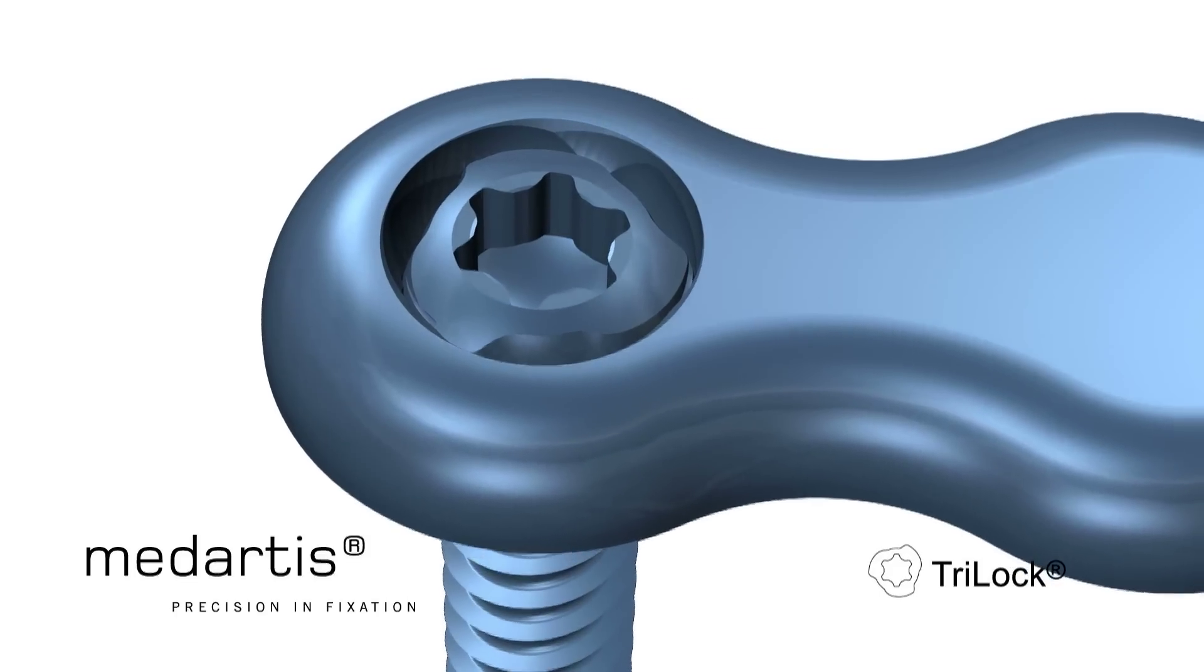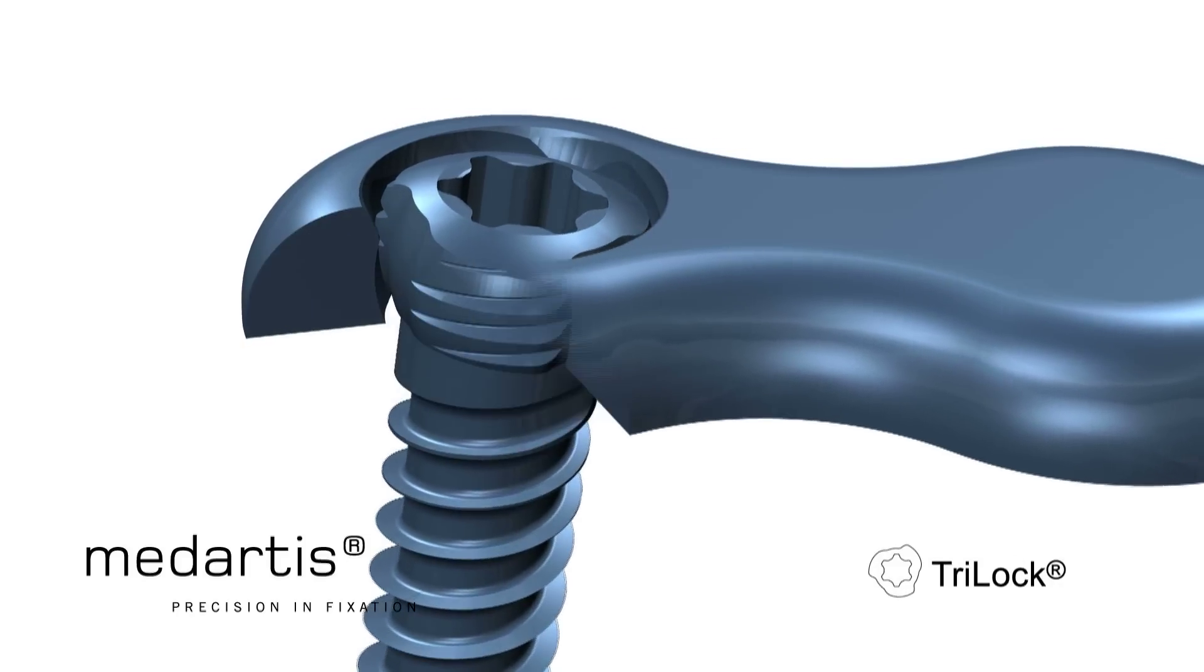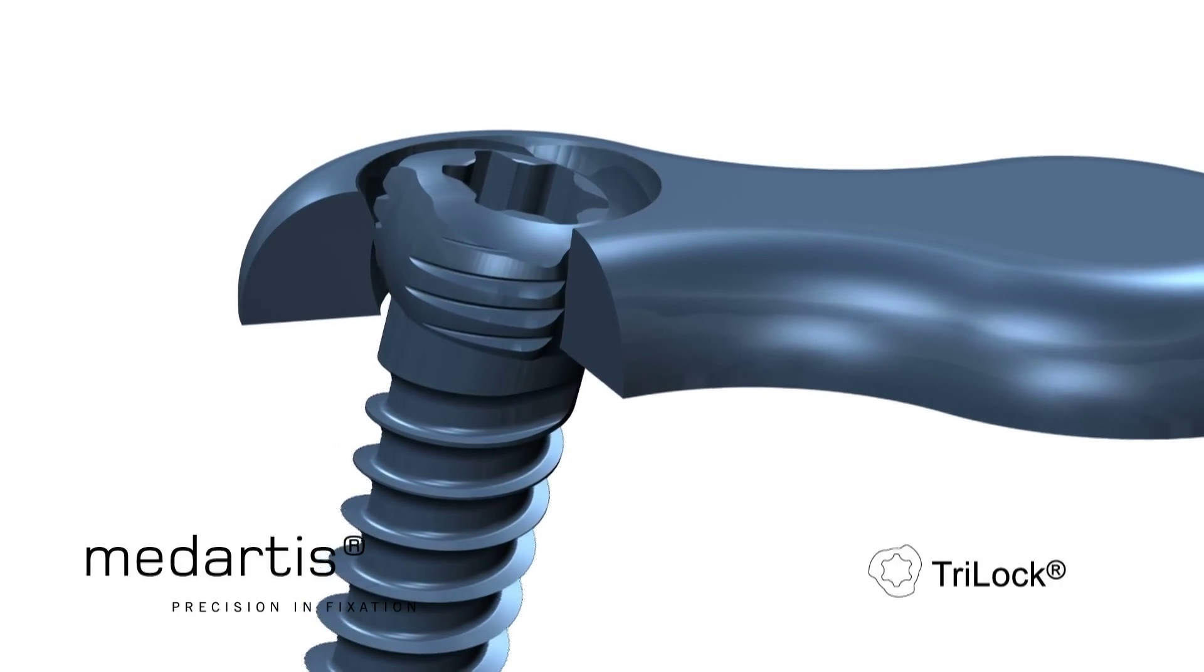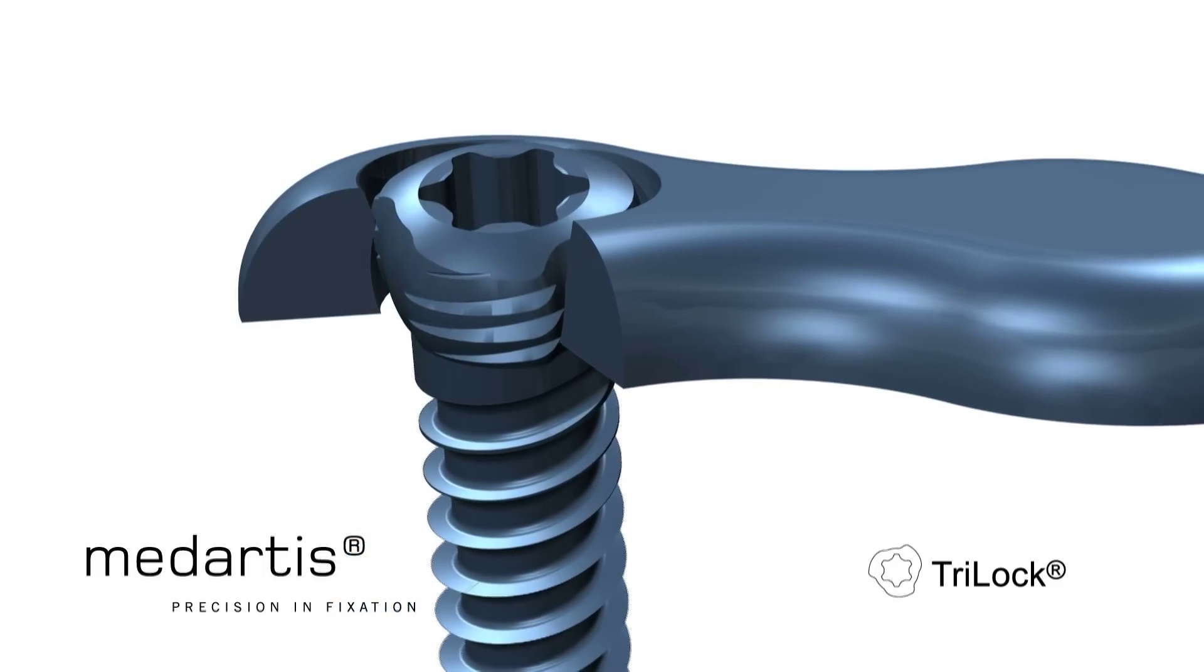Due to the spherical head geometry of the screw, any user-defined screw angle within the angular range of ±15 degrees can be permanently locked. The screw head protrusion is very small, even in the maximal swivelled state.